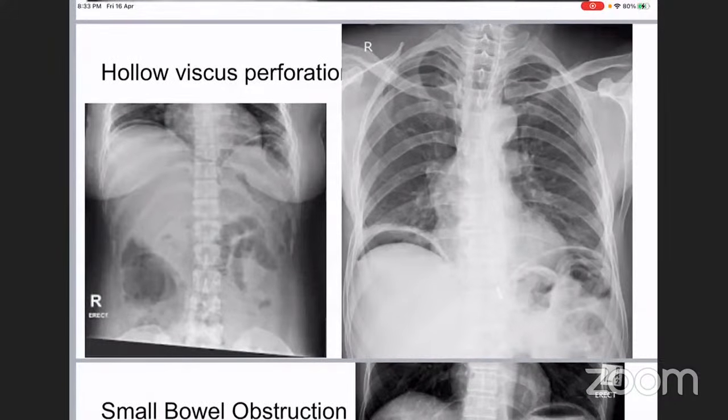Okay. And then what are the other important signs of pneumoperitoneum that you know? One is cupola sign, which you can see here. There are several other signs. One other sign you can actually see in this image, especially on the one on the right hand side, towards the left upper quadrant of the abdomen. What sign is that? You can see both the outlines of the wall of the bowel, right? What sign is that? Okay. So it is called Rigler sign, R-I-G-L-E-R. That is when you can see air on both sides of the bowel wall. It is also called double wall sign or bas relief sign.